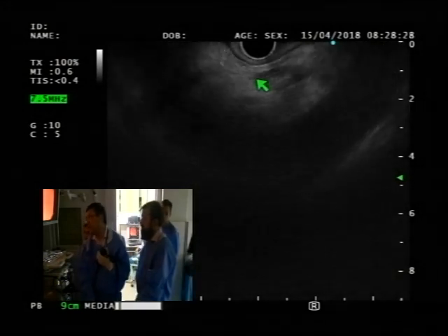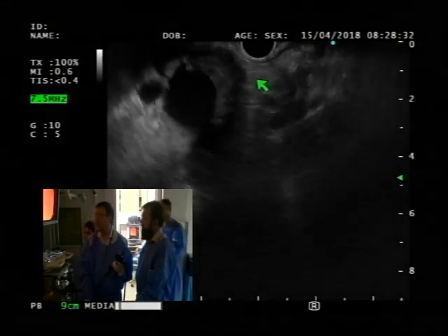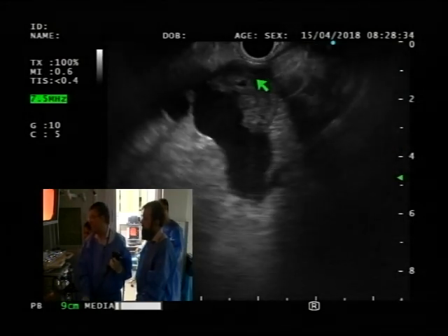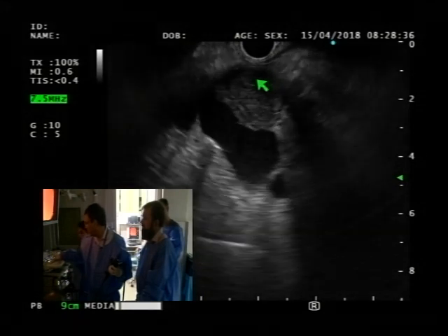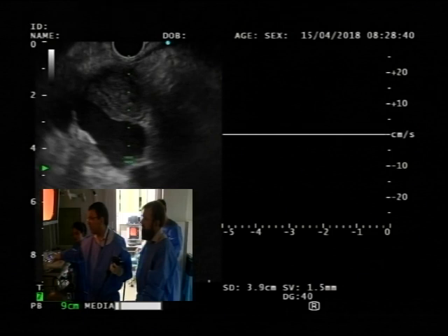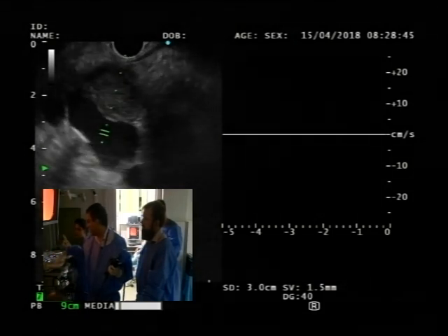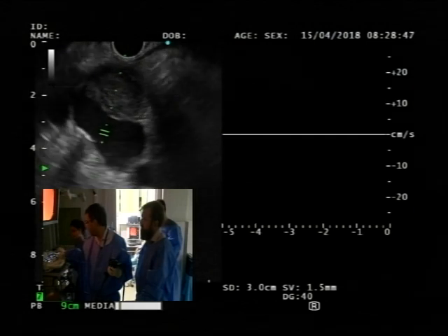And they did not mention anything about the clot itself. Yeah, I'll go straight to that. Hold on, just give me one second. I want to do one more thing. Let me see what type of waveform we are getting. The other possibility we have to think about is an aneurysm there.